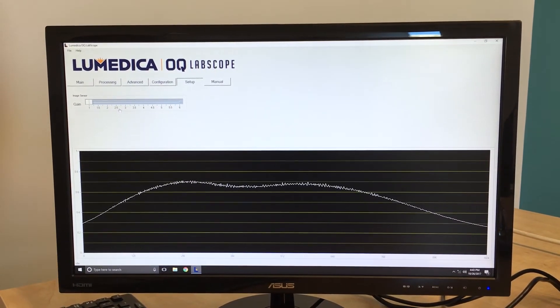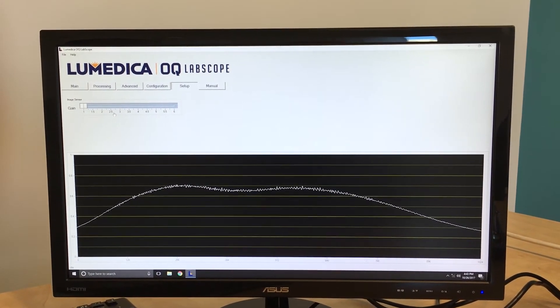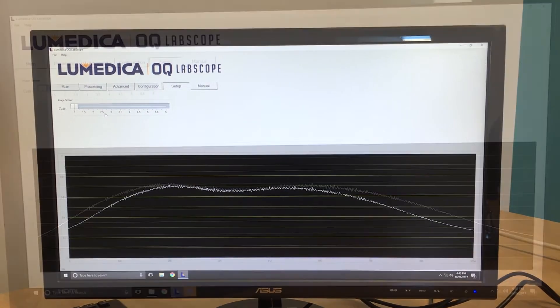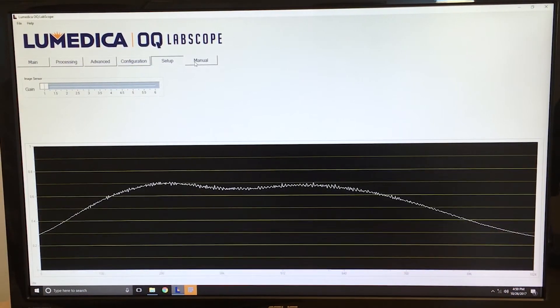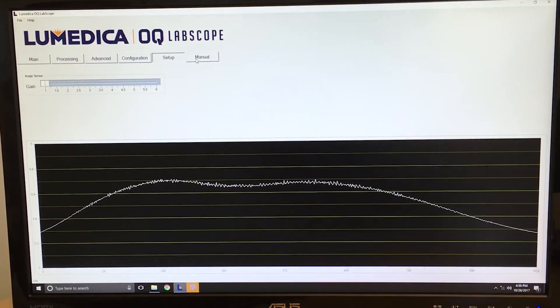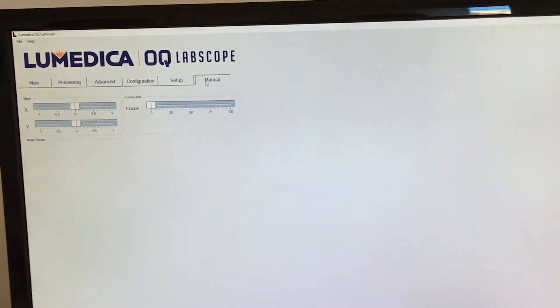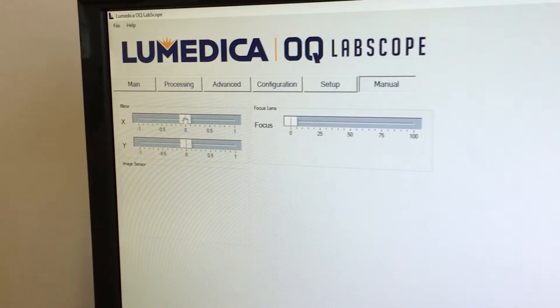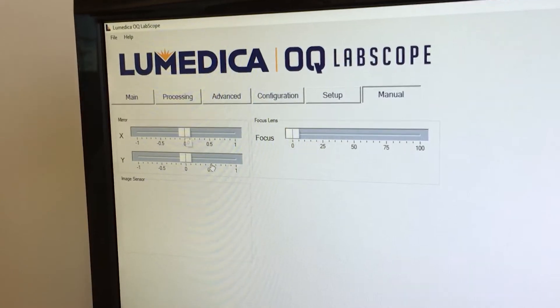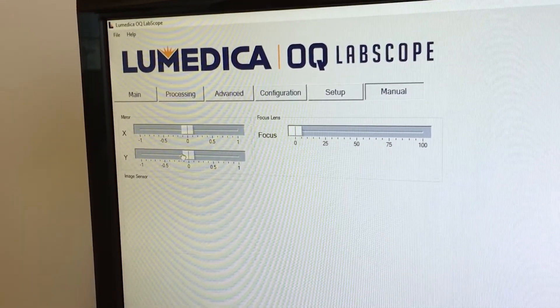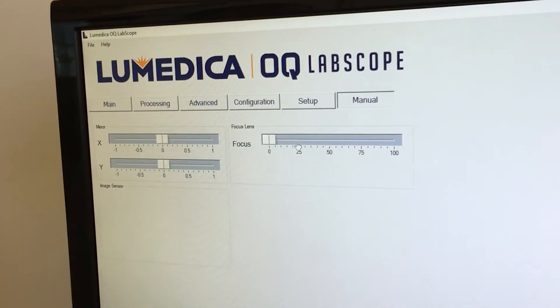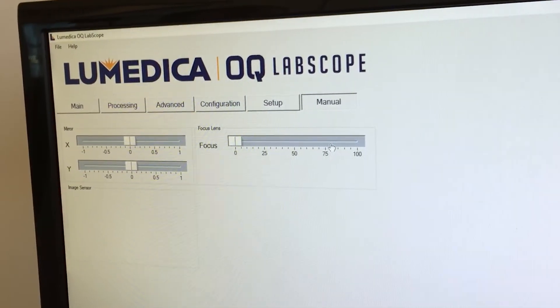This can be useful for weakly scattering samples that may need a boost in signal. The last tab allows the user to control manual settings of the Labscope instrument. For example, you can directly change the position of the MEMS mirror in both X and Y, as well as to adjust the focus of the liquid lens.